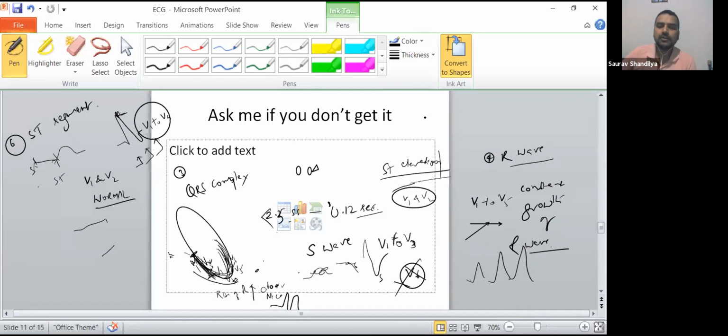Now, next point, you note it down. Here only I'll write it down. I will not go to another slide. You can write it down. T wave. What is the problem with the T wave? What should you understand with the T wave? T wave is upright in lead 1, lead 2, and of course V2 to V6. Repolarization, right? So repolarization always gives a T wave like this. If it is a T inversion, there is another problem. Generally in these leads, it is fine. Okay, fine. So these many things I'm telling you just to help you understand.